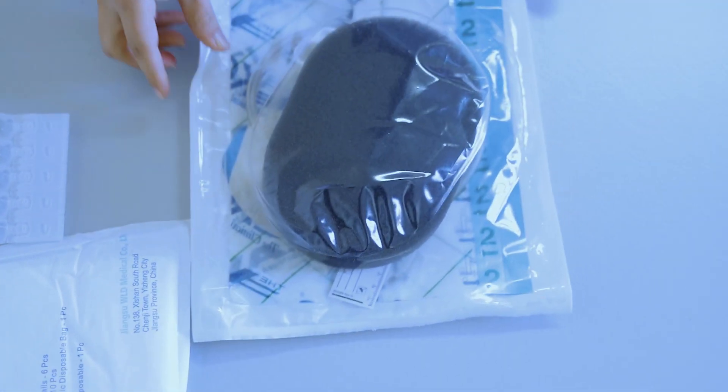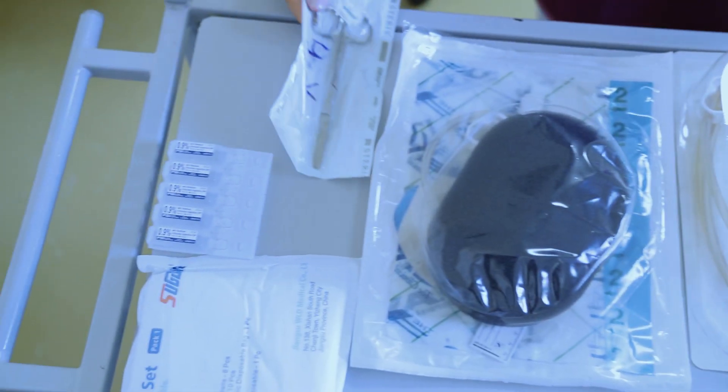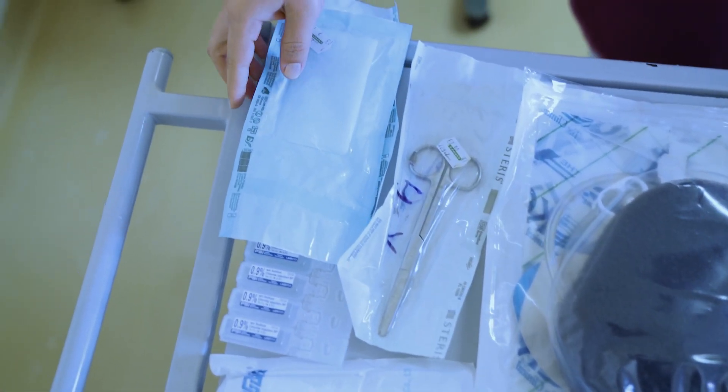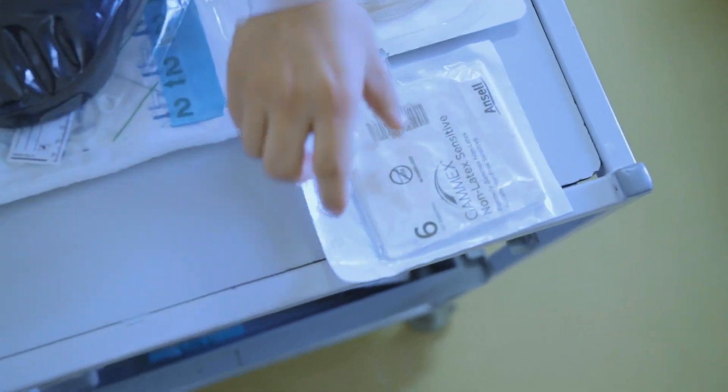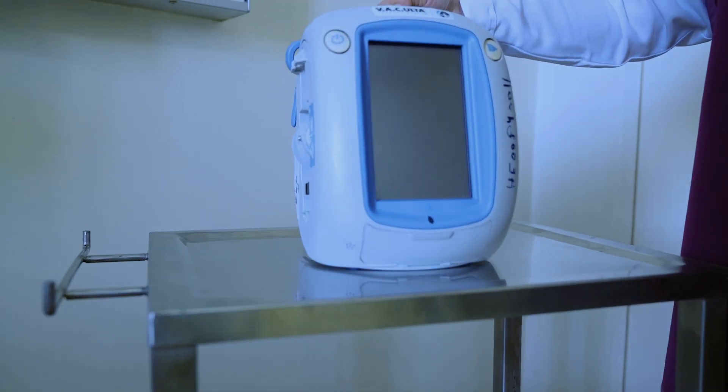Before going to the patient, prepare the following items: dressing set, normal saline, VAC dressing kit, VAC canister, sterile scissors, sterile gauze, sterile gloves, clean gloves, and VAC pump.